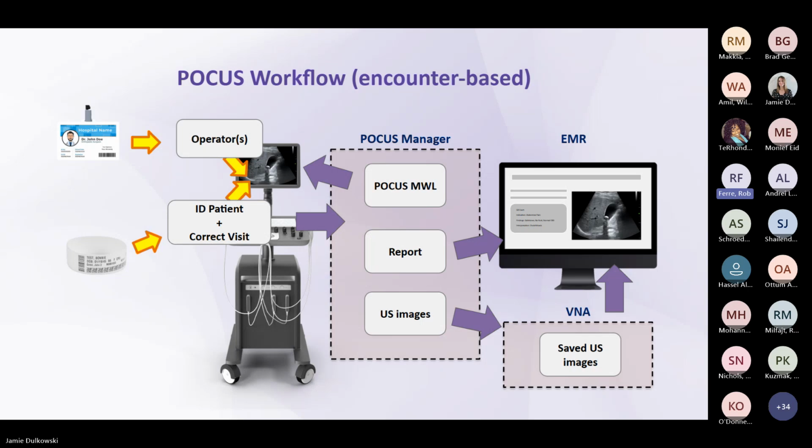That is the reason why we distinguish between operators who have point-of-care ultrasound privileges and operators who do not, and the point-of-care ultrasound manager helps us to do this. Eventually, it receives that completed study where a report can be completed, and then images can be archived to the VNA, and the report with linked images can be found in the electronic medical record. Next slide.